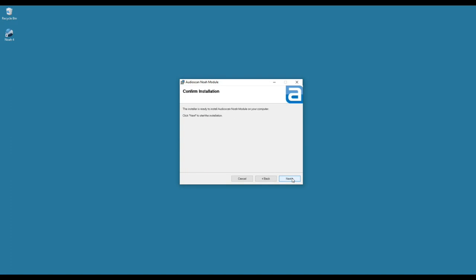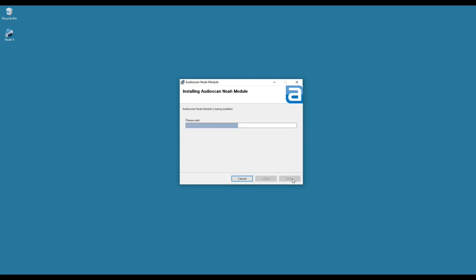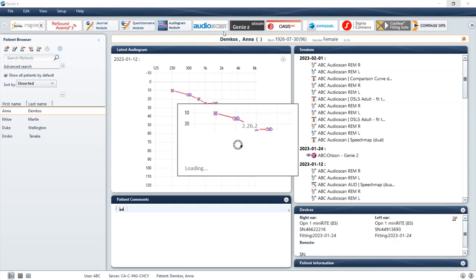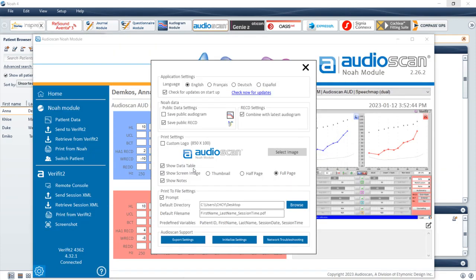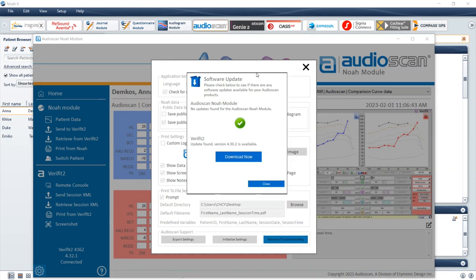The AudioScan NOAA module will close, and an installation wizard window will appear outside of NOAA 4 for installing the software update. Once complete, reopen NOAA 4 and select the AudioScan NOAA module. The installed software version will now be the most recent software version available.